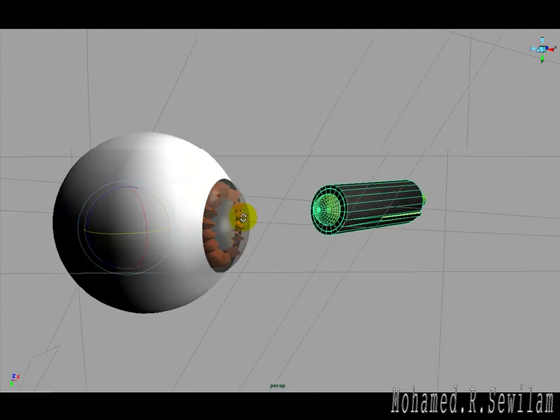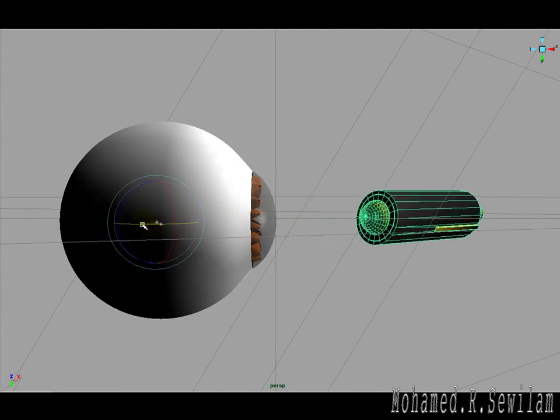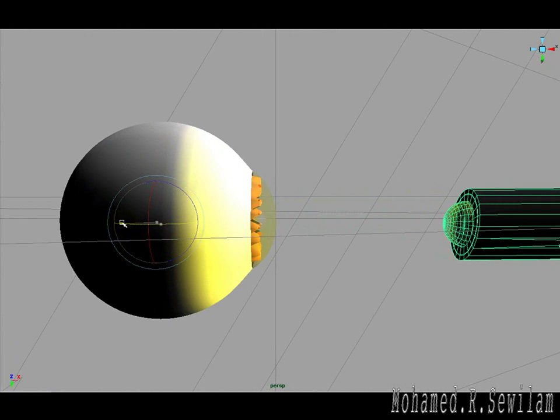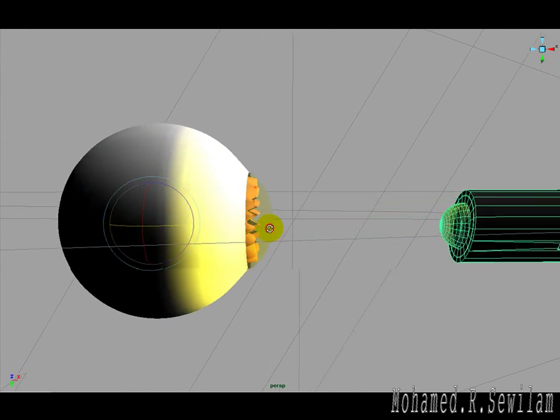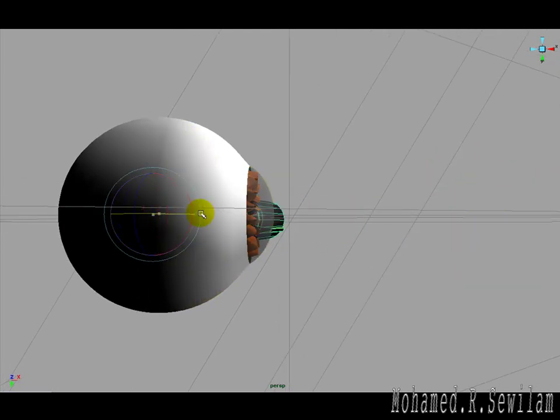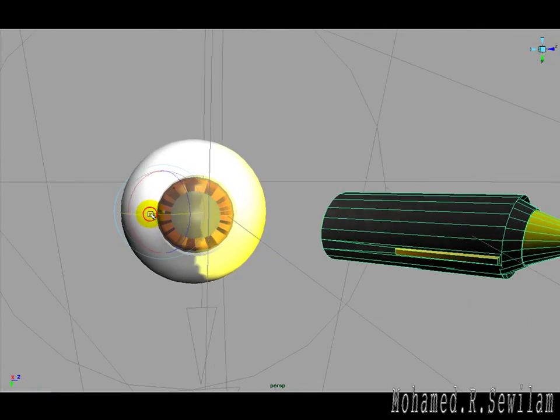First, let's take our torch from the nasal or temporal side, and I'm looking from in front. Now I'm looking from the side, so that my torch should be from in front of the patient. So as I can see the space between the iris and cornea, which is the anterior chamber, I can estimate its depth from here. Now this is a shallow anterior chamber.